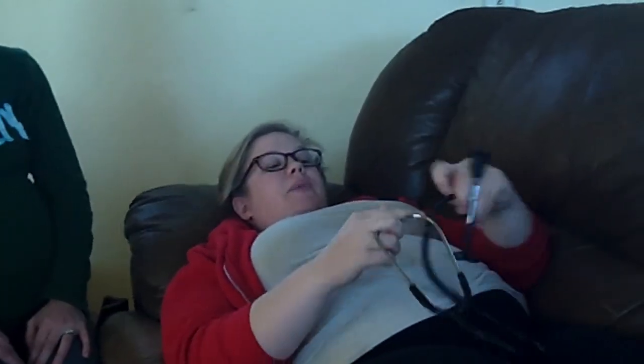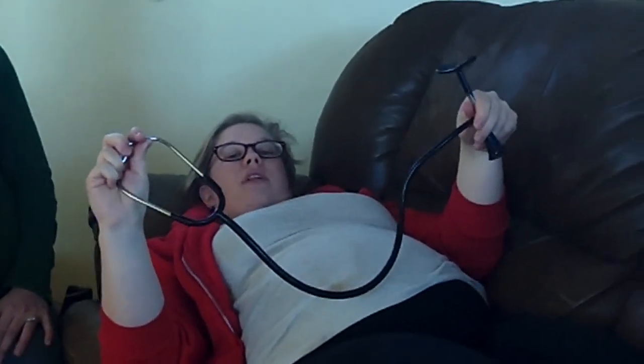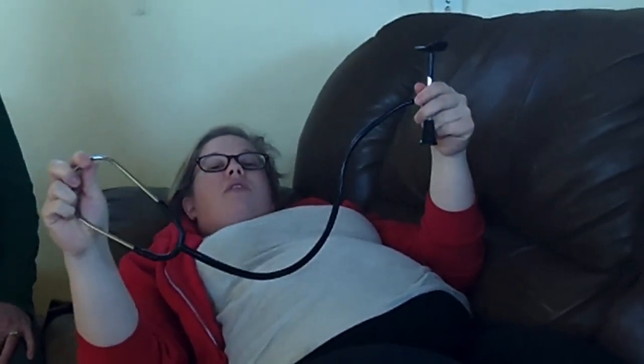Hi, we're back at Indie Birth headquarters here, talking about finding your baby's heartbeat. And Margot is going to give us a little demonstration on how you might go about finding the heartbeat when you're early in pregnancy. All right, so we already talked about how this long stethoscope is really the ideal tool, and I believe Mary and I will both be using this in our demonstrations.